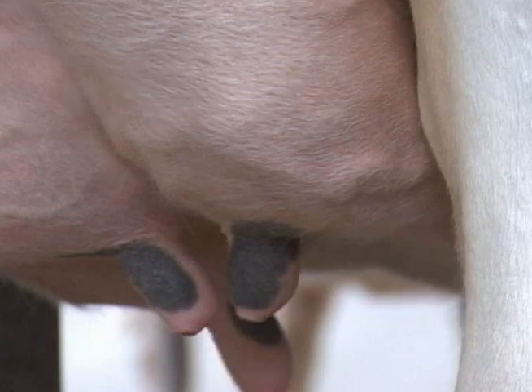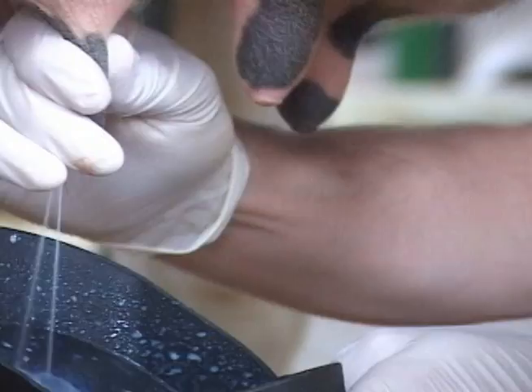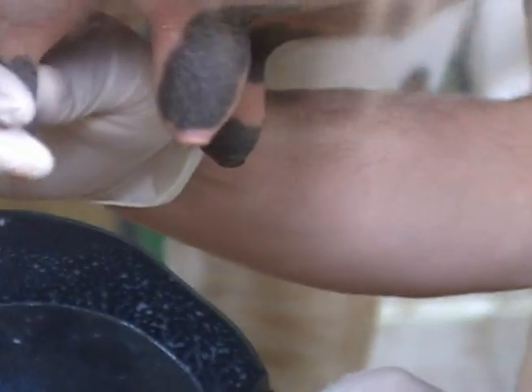The first step is to make sure the teats are clean and free from dirt. Then, force strip in a strip cup and check for abnormal milk.